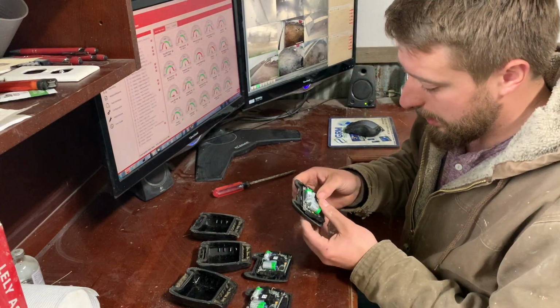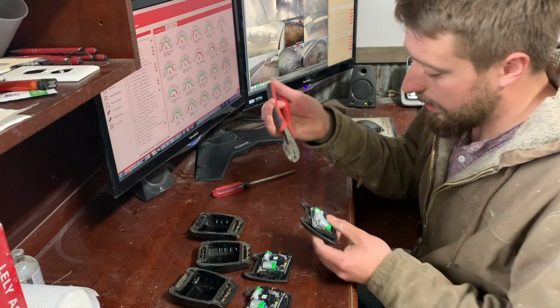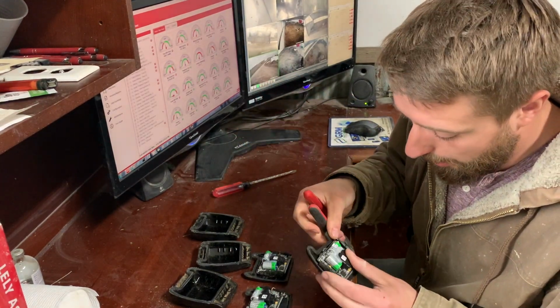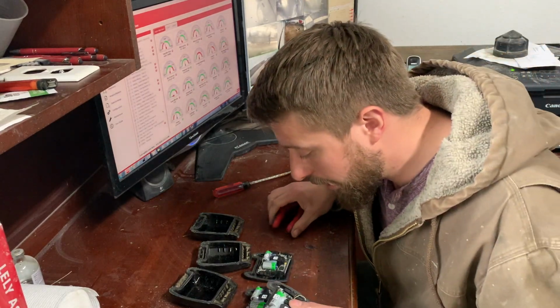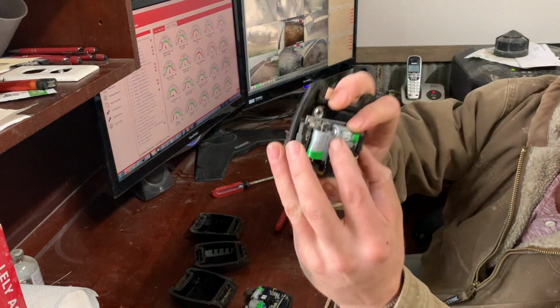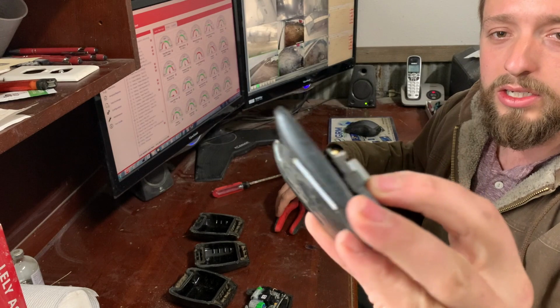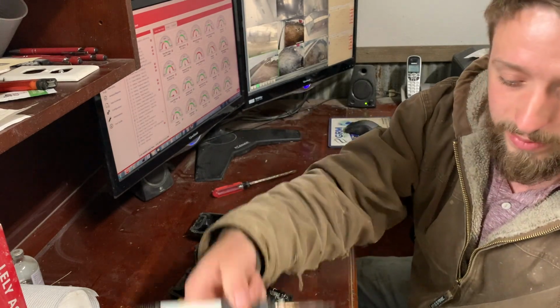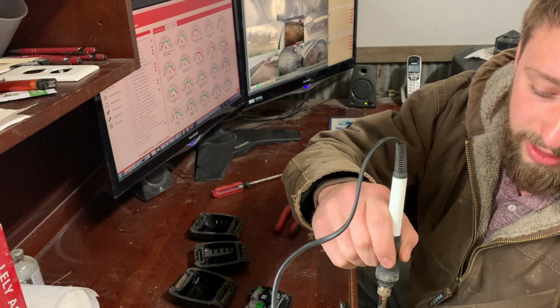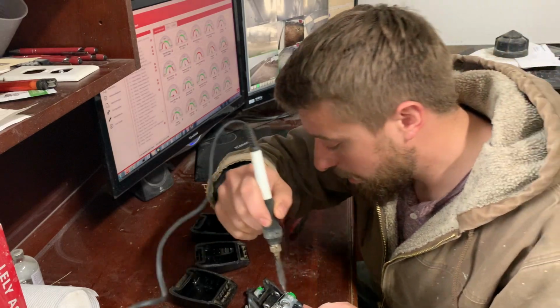Okay, and then next I like to have clippers. This is a wire, electrical clipper. On some of them you'll see between those two there's some caulk and stuff that gets in the way. So I use my soldering iron and just heat that up a little bit so that you can get your wire clippers in there, and so that you don't tear up anything else.